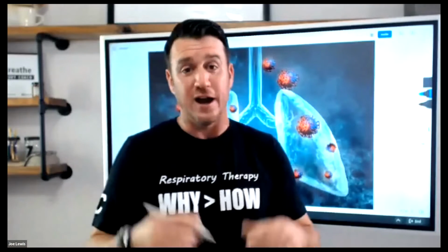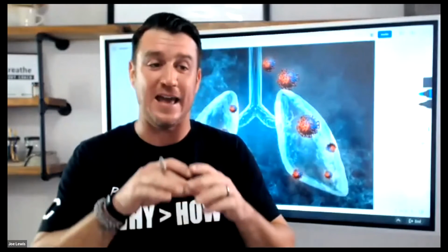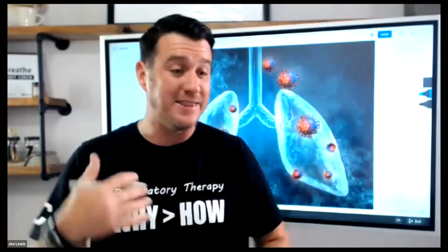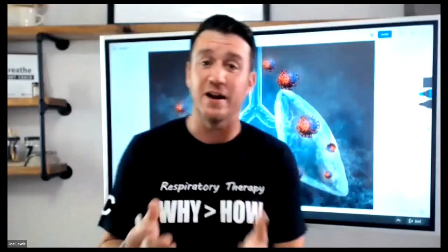So the second we start applying positive pressure to our patient's lungs, especially if we're not doing it in a safe manner, avoiding barotrauma, volutrauma, and atelectrauma, then we are starting this inflammatory cascade, the release of cytokines that go throughout the body. And this is the beginning of multi-system organ failure from biotrauma.